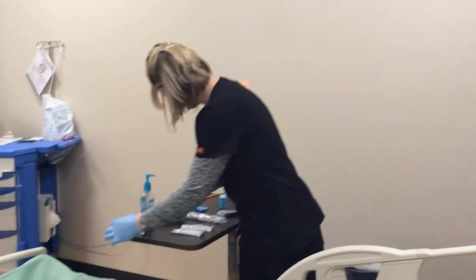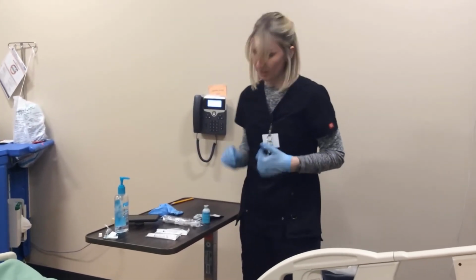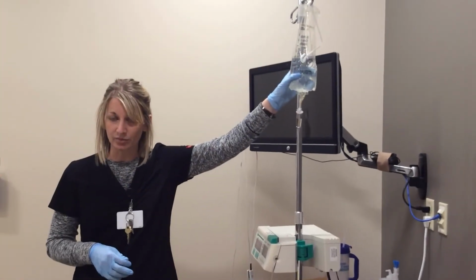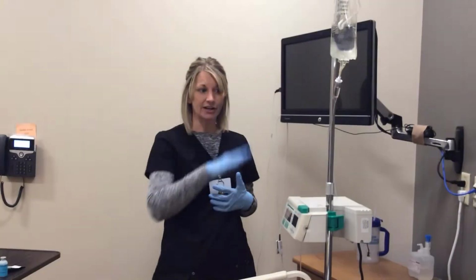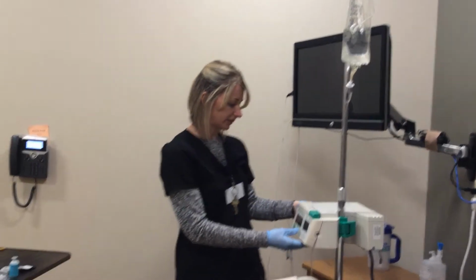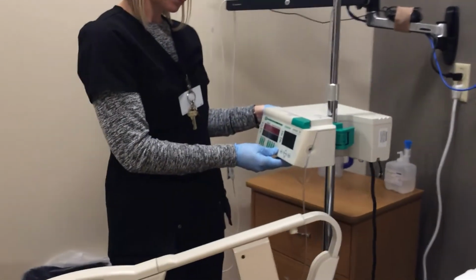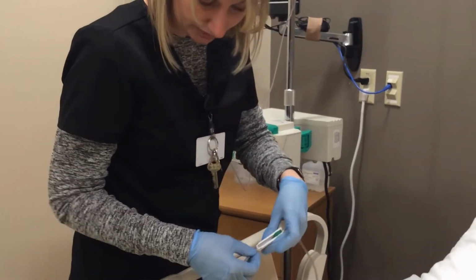All right. So now let's say I'm going to be giving him Solu-Medrol, but now I've got something else in here, and I know it's not compatible because I've done my compatibility check in the computer or on a chart, wherever it's located in our facility. So what I'm going to do is I'm going to hit hold on my pump. If I didn't have a pump, what I could do is I could close my roller clamp.